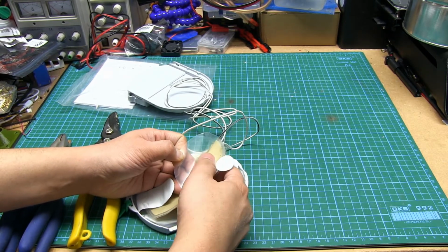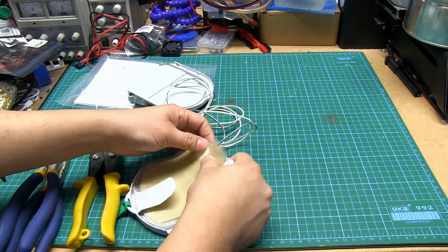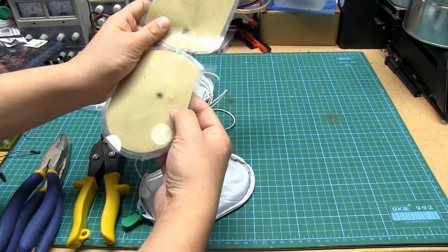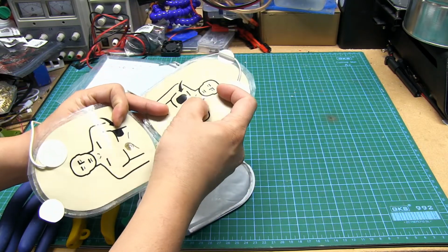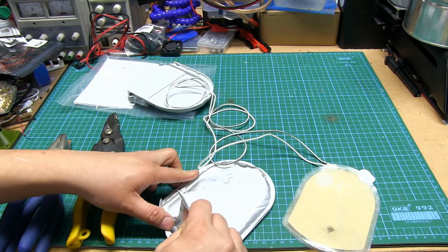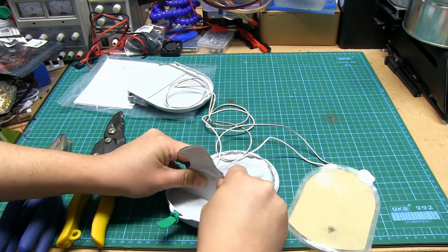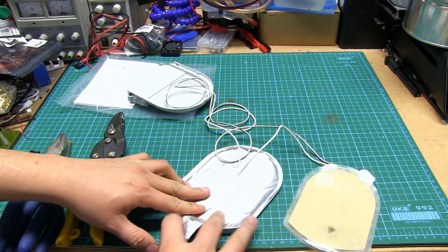These hydrogels actually still do have some adhesion, and they still smell just as awful. You can see the small hole that was burnt into the pads as a result of the, shall we say, lively discharge. Either way, the foil packaging itself is just glued in with some pressure-sensitive adhesive. You can tear this off, and there's really nothing spectacular under here. It's literally just glued in.